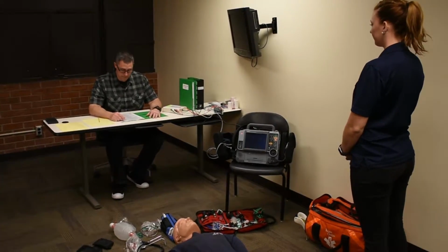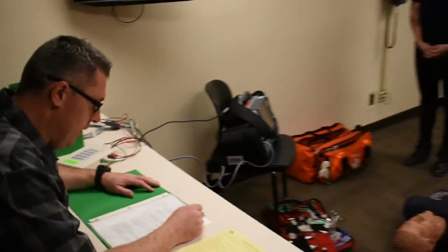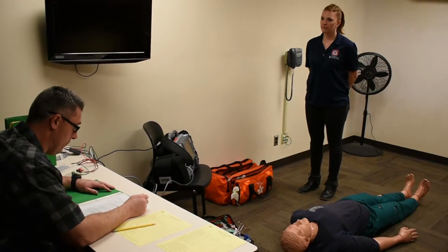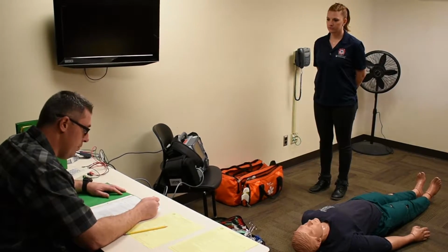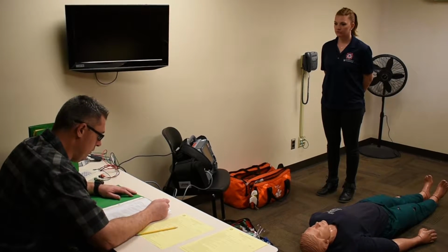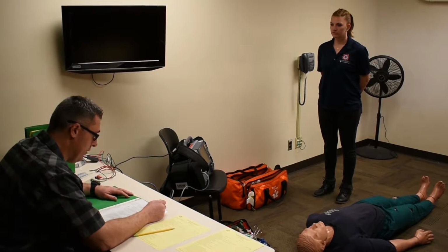I do not. Your patient is a 55-year-old male with the chief complaint of the heart beating funny. Okay. He was working out in the yard and felt funny, so he came in and called 911. The patient's heart rate matches the monitor with a blood pressure of 100/70. Pulse ox is 93% on room air. Lungs are clear, equal, and bilateral. Finger stick is 80. Temperature is 99 degrees Fahrenheit.